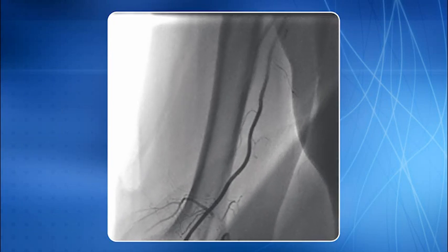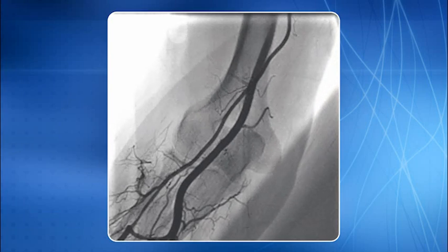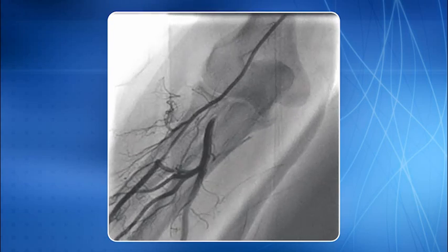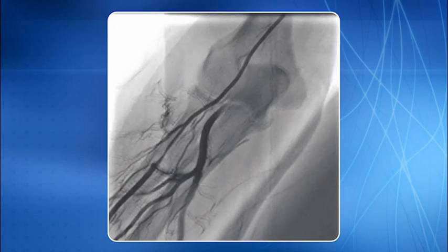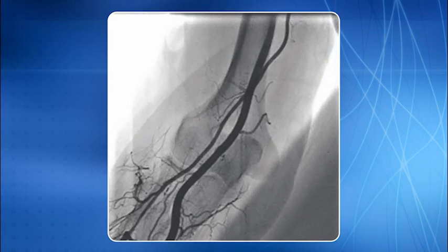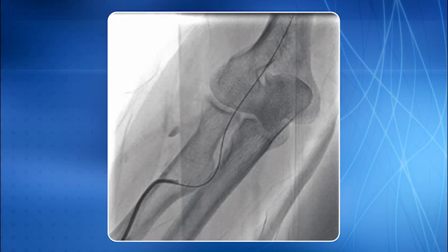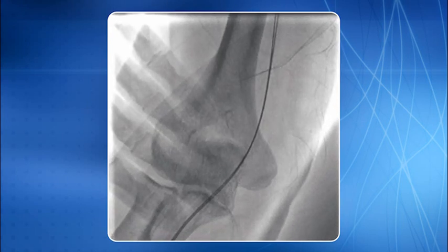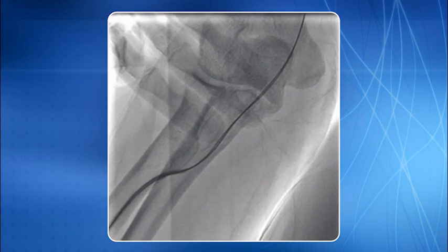Avoid the temptation of going through a small calibered radial artery because it will almost invariably lead to significant pain and discomfort to the patient, and the failure rate will be high. Instead, you aim at negotiating the wire through a bigger branch, that is the communicating artery, and enter the large brachial artery. Once the wire placement is done, the catheter can be negotiated over it through this region. Once the catheter tip reaches the brachial region, the procedure can be completed in the usual fashion.